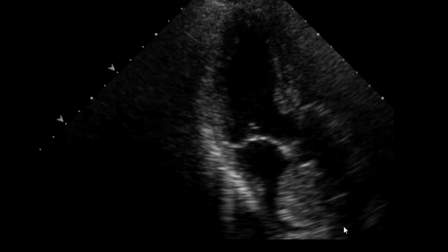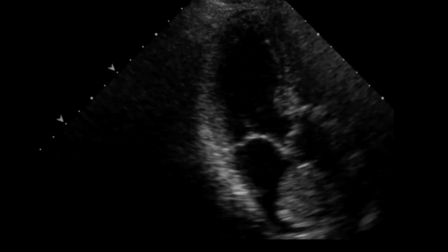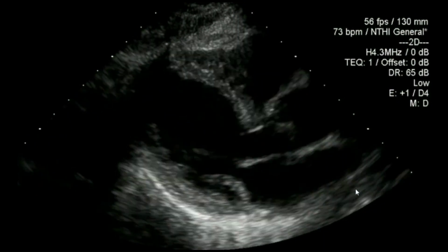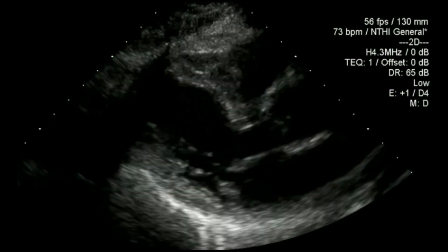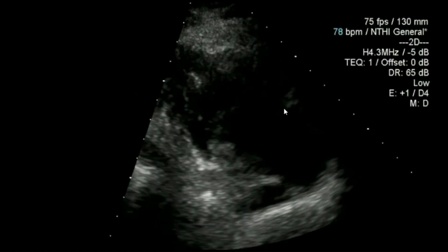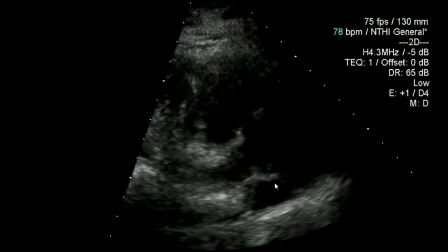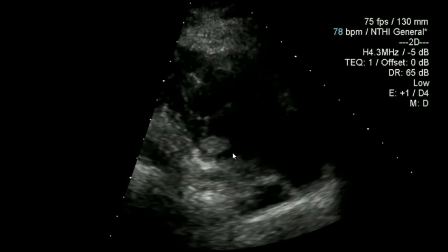And last view here, just the apical view. As you can see, it's quite low down in the atrium when you see it from that view. In the same patient approximately 10 years later, we can see now the left atrium was quite clear, nothing of any concern going on there. Tilting over towards the RV inflow view, we can see a leaflet there, the anterior leaflet, and we can see a leaflet just here as well. And when we look at it, we can see a degree of thickening around the base of that leaflet.